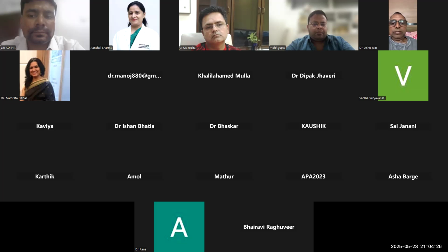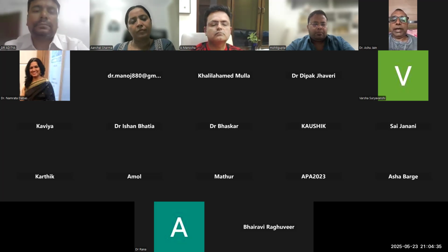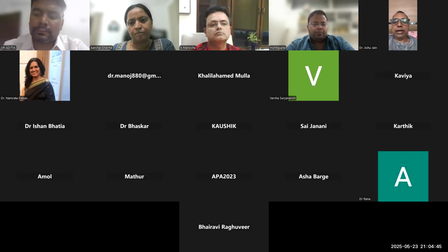So you still believe in those 3 targets which we normally target using fluoroscopy? Yes. And the point well taken from the second study is about the infrapatellar target after post-TKR. We get these patients, and probably now we will try to do that under ultrasound guidance, give a diagnostic block, and if it is okay, then go with the RFA.